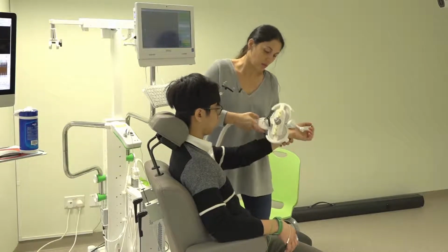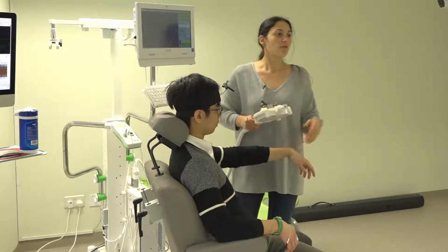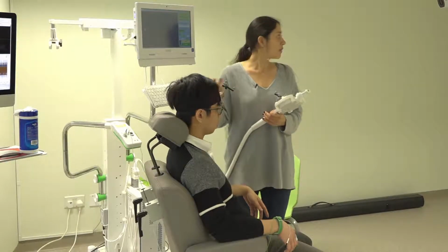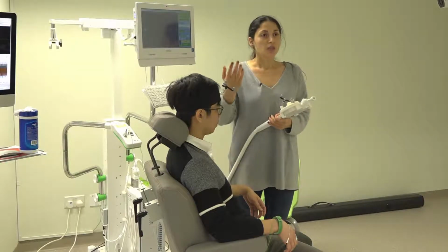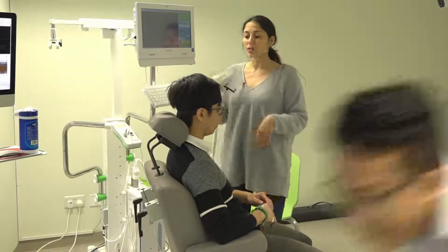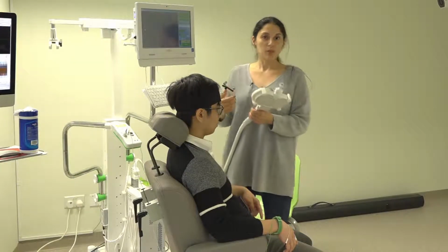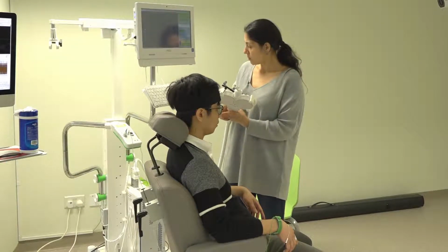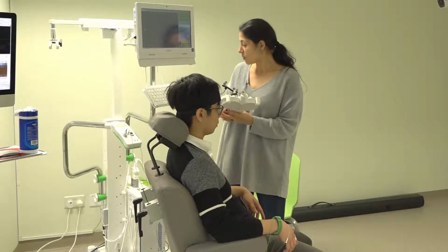So that he feels and has an experience with the TMS. When you are going to have a person for the first time, you really want him to be very relaxed with this thing, right? So just another way is to put it here in the back part, like in the shoulder, so that they feel that, and you explain before applying the stimulation. When you don't know the person, you can start with 40 stimulator output.